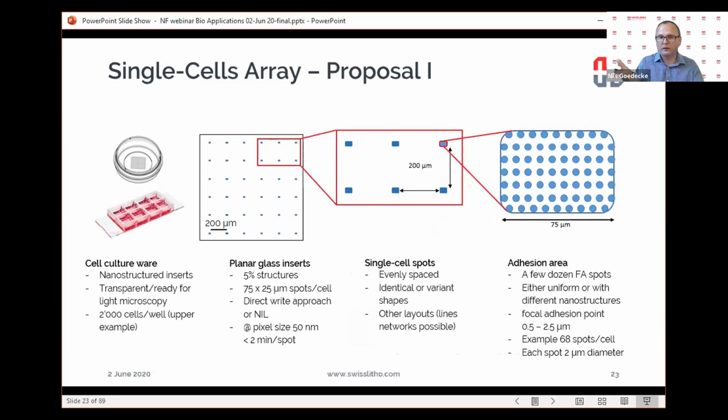And then we have to make the decision, do I want different ones? I could go and structure directly or stamp. And with this, you can have different roughnesses, and each different roughness means that, especially with stem cells, that means stem cells can be guided by different roughnesses to develop into different cell types. And I think areas like this, substrates like this, are very interesting to anyone who is into mechanobiology and looking into cell mechanics, because cell mechanics are very interesting in connection to genetics.